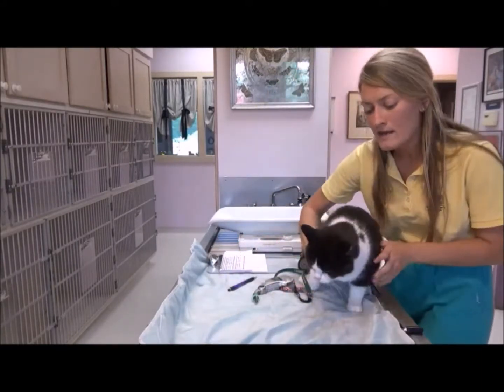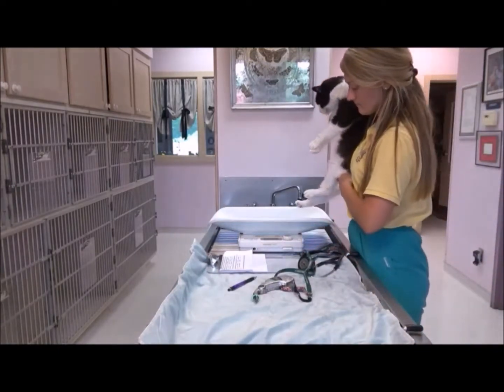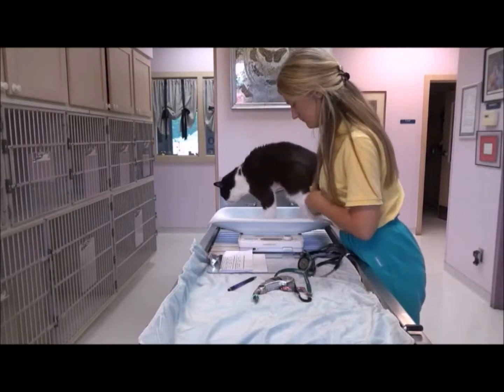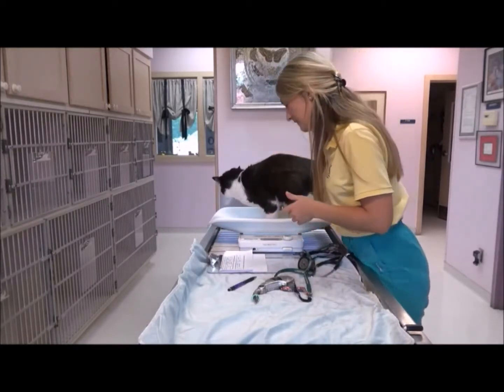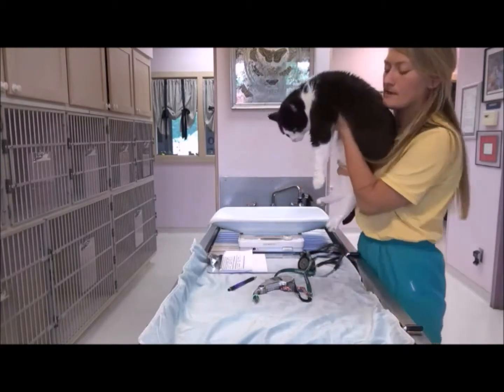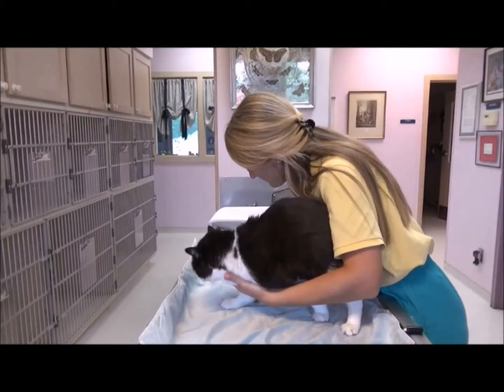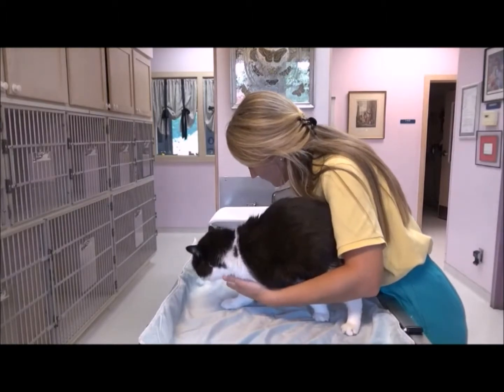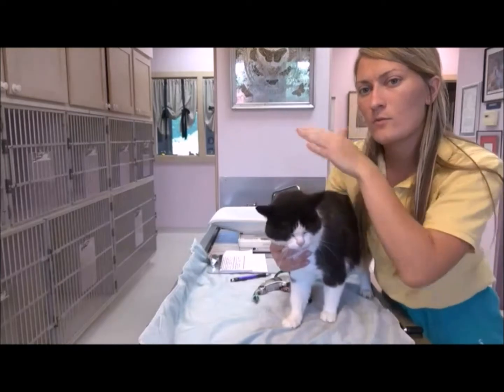Next, I'm going to get his weight. Good boy. 11 pounds, 13.5 ounces. You're a big boy, Chance. Okay, so the same as with our canine patient, I'll start from the head and work my way back.